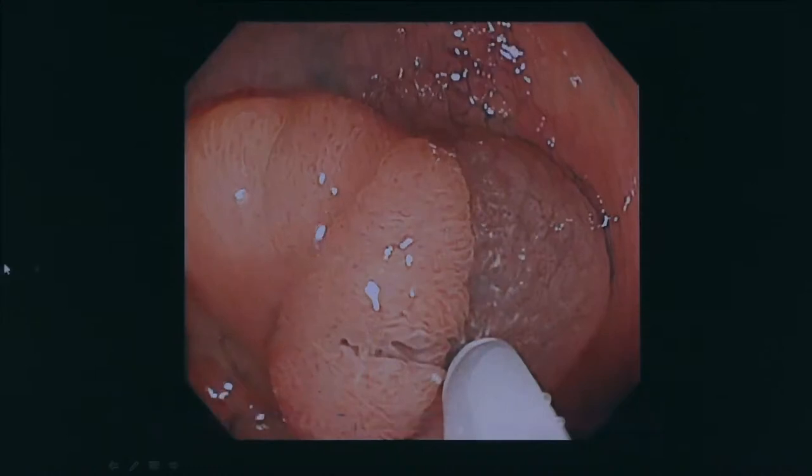And again, at the center, it was not lifted very well, so I added some solution at the center too.